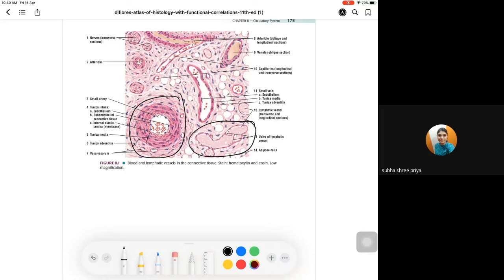Yes, that point is very, very important. No RBC. It is having some fluid and some lymphocytes. It's a lymphatic fluid that looks more pinkish. That's lymphatics. Whereas here, arteries and veins will have RBCs. That you have to remember. In case of lymphangioma, they are dilated lymphatic vessels without any RBC, a lot of lymphatics. Whereas in hemangioma, it's an increased number of dilated blood vessels with a lot of RBCs there. That is very, very important.